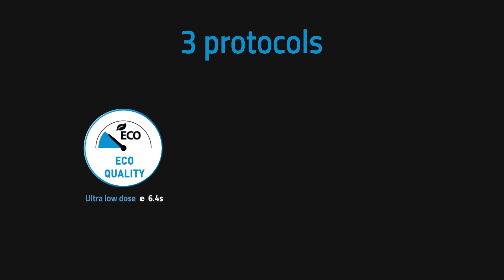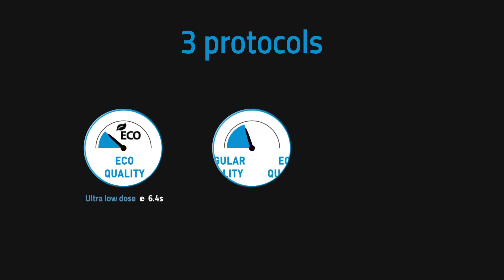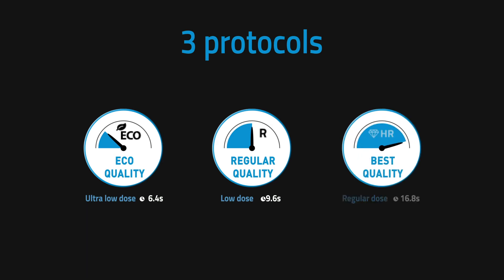Supported by user-friendly protocols, dentists can select the most appropriate of three protocols and conduct examinations for a range of clinical specialties — from implantology to the measurement of maxillary sinus volumes, from endodontics to oral surgery.